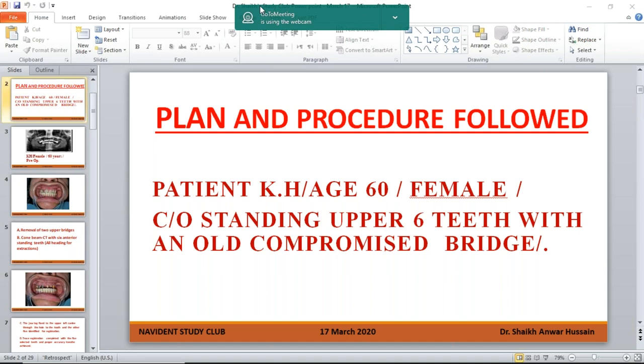I do have a question also for Dr. Burgess. He showed us the methodology he follows for treating a totally edentulous patient, which was incredibly clear and logically developed. You've been exposed to the new trace and place protocol for totally edentulous patients. How do you envisage that might affect your clinical protocol, and what would eventually be the benefits of the new total edentulous protocol? So we're talking about being able to take the CT scan with bone screws or little markers.